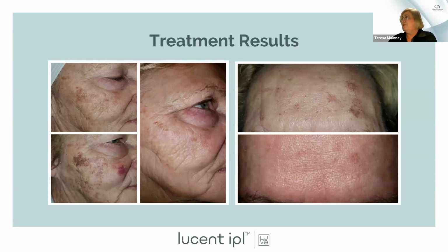I have the screen. I'm going to go to 4 or 515. Let's go into our P1. I'm on a single pulse, 4 milliseconds, 12. It does go up by 2, but it's going to monitor you. You can't stay at 4 milliseconds. The machine goes, okay, if you're going to do that, I have to bring the milliseconds up a little bit because you're going in too aggressively, but you still need to have that energy go up. So when you start moving up, your milliseconds will change, but you're right, it will not allow you to stay at the 4. It will adjust up, so it's sort of going with you, because you're using the little square. I hope that answers your good question. Thank you.